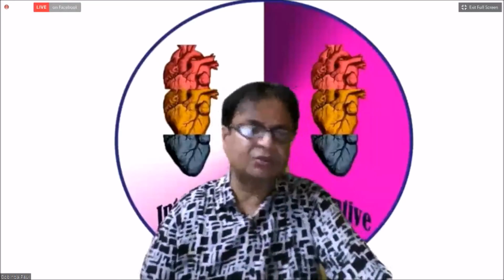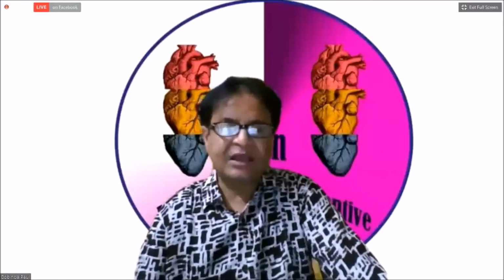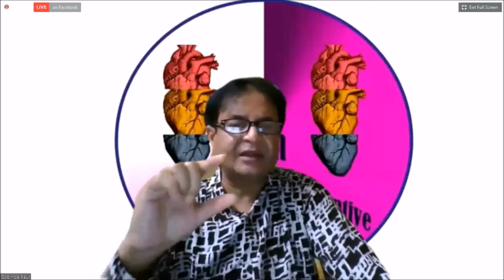Thank you, sir. Another question is, by TAPSE we measure right ventricular function. Like it, can we use MAPSE, that is mitral annular plane systolic excursion, for measurement of left ventricular ejection fraction? Yes, of course. I have shown this in one of the slides. The M-mode cursor is placed in the apical four chamber view along the lateral annulus, with movement towards the apex, just angulation to some extent. And we can measure it in the M-mode image.